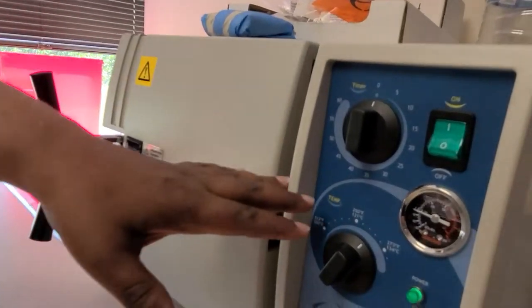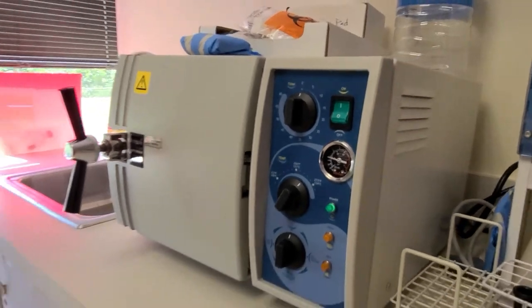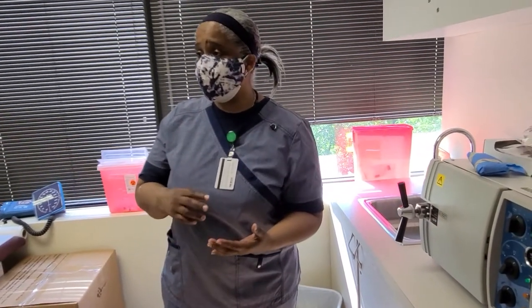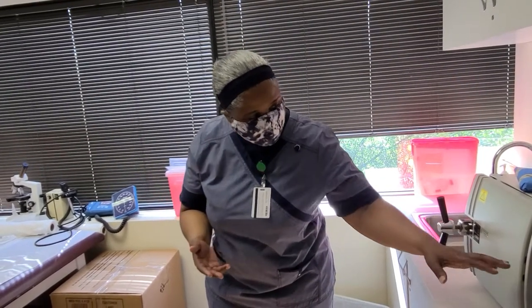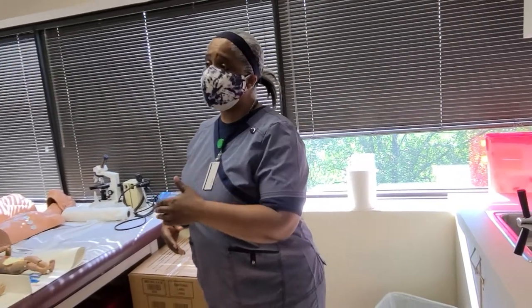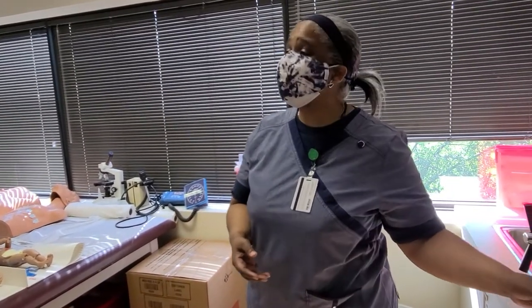An autoclave with steam heat, because that's what we use. We don't use gas or anything like that. In the medical assisting office, we use an autoclave that's anywhere between 250 and 273 degrees Fahrenheit. If I'm doing something light, like a soft tissue pack, I'm going to set somewhere halfway between 250 and 273, and my time is usually going to be between 30 and 45 minutes. But if I have heavier instruments, like a bone pack, then I'm going to do it for at least an hour.